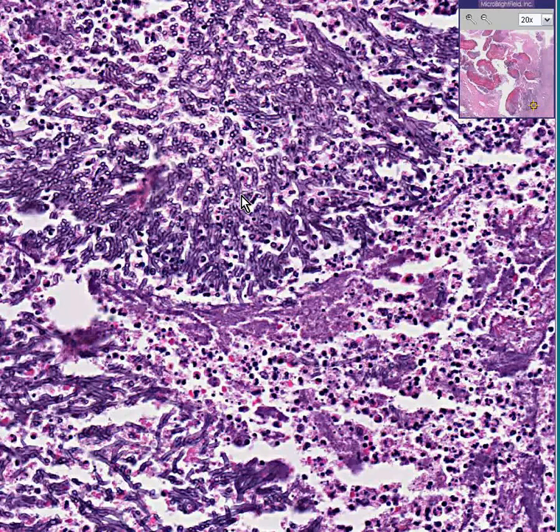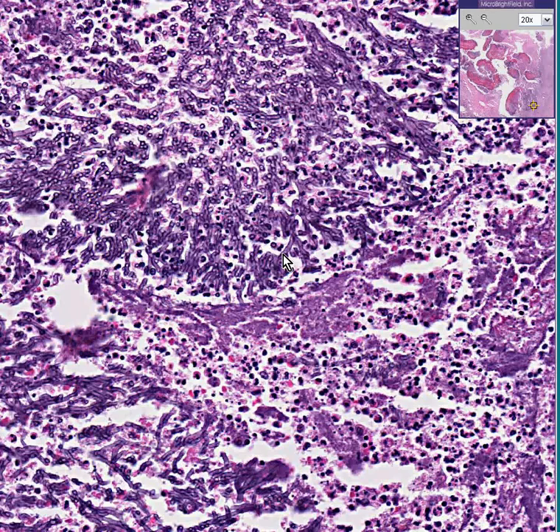But here are the hyphae, here is how they branch. The microbiologist told me that they branch at 40 degrees as compared to Candida, which branches at 45. Quite frankly, I don't think I could tell the difference. But here they all are, and this is not a fungal stain. This is a regular H&E stain, and you can see that the lung is just loaded with them.